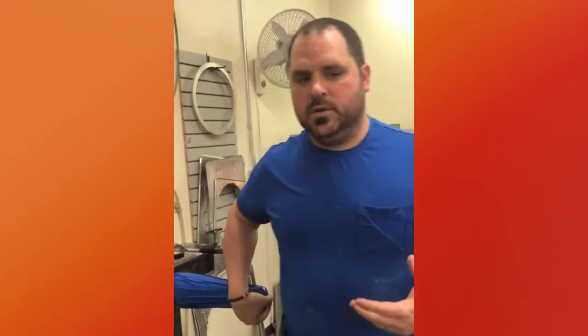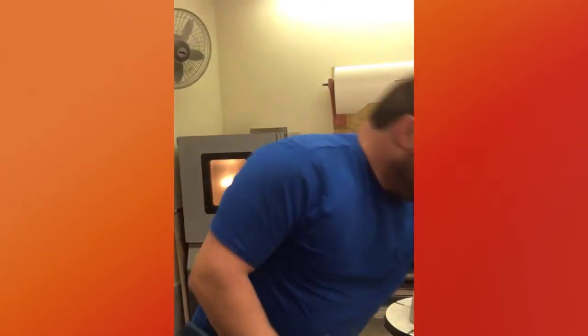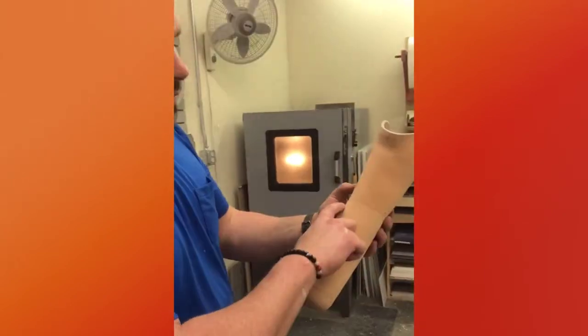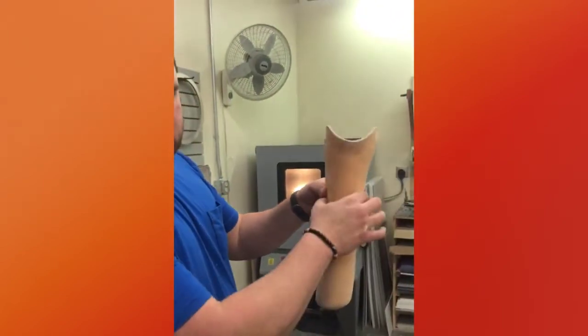So that's going to make the inner layer of the liner. Then we go back and we build it up with extra layers, so it makes this nice stovepipe shape.